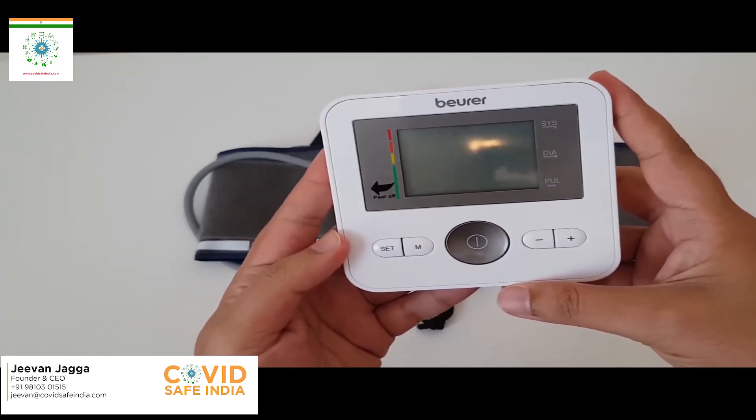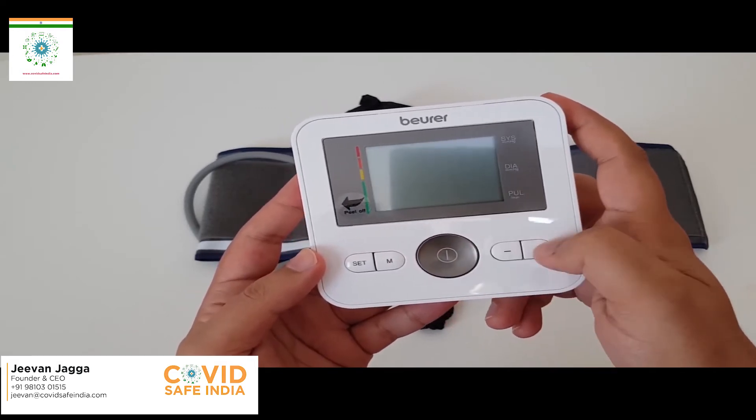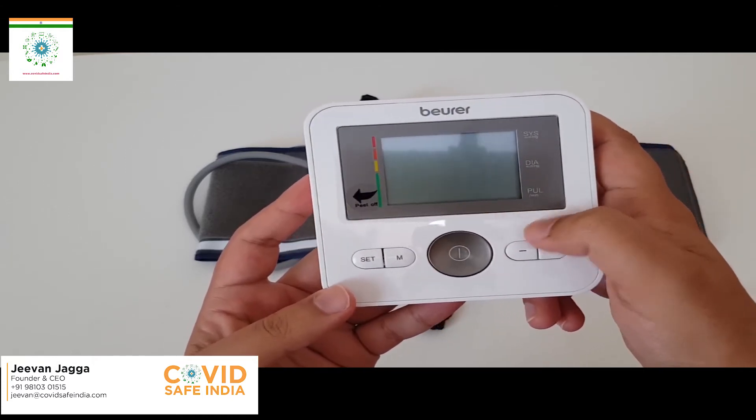I'm just done with the installation of the batteries inside the module. It says 24-hour format — that is the format of the date you will be using. Perhaps 12-hour format is fine.